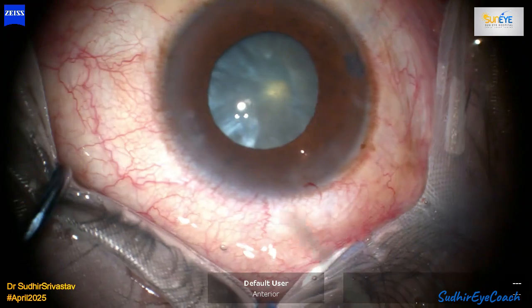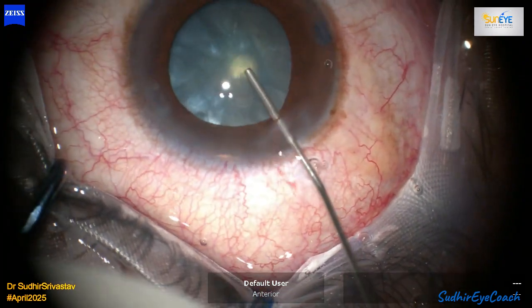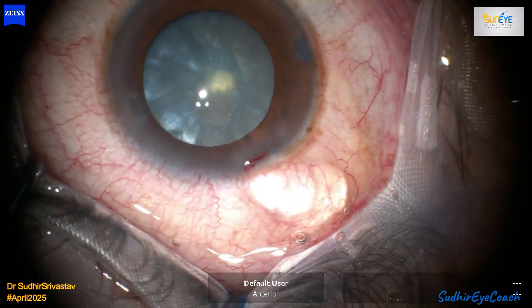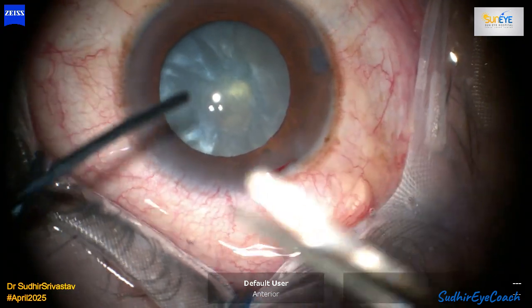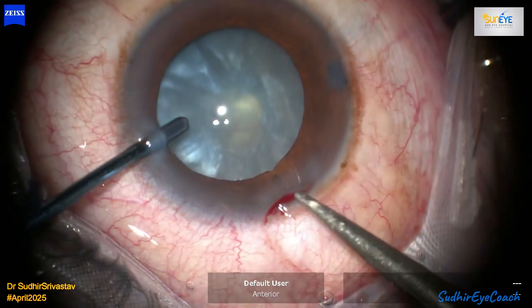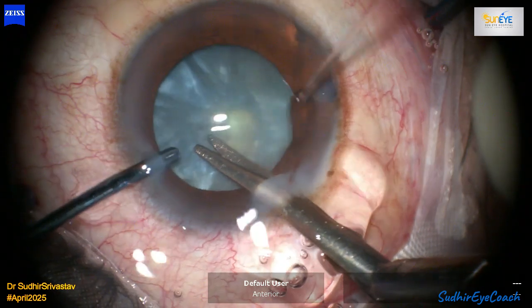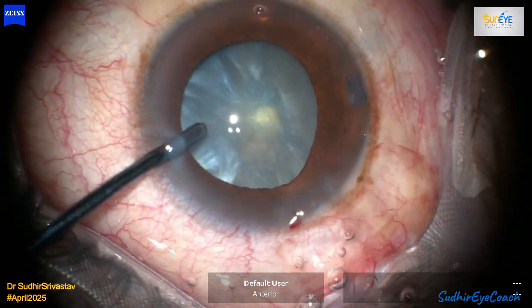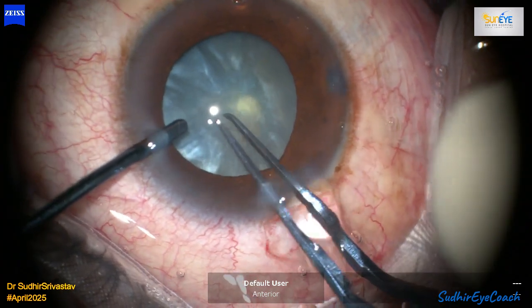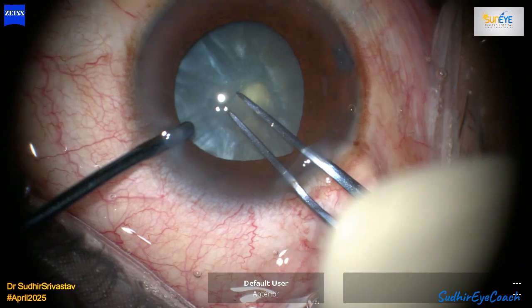Once I was confident in its stability, I informed the patient about this intraoperative complication and the management. I also explained that if decentration occurred later, we could easily explant the lens and replace it either the same day or the very next day. Thankfully, the IOL stayed perfectly centered, and on follow-up even after six months, the patient maintained excellent vision with no decentration or posterior capsular opacification.